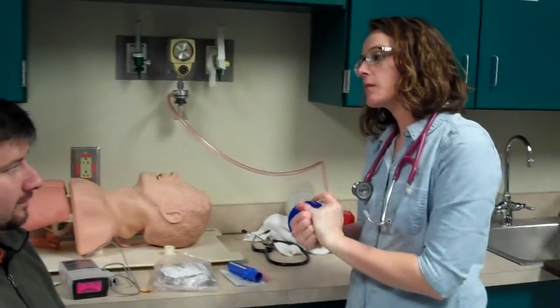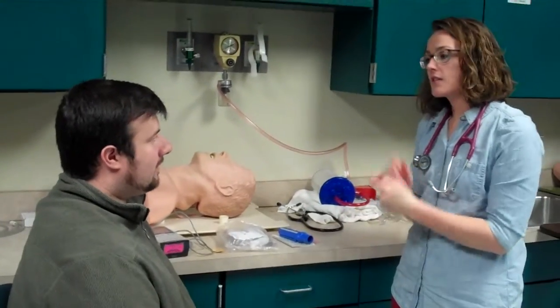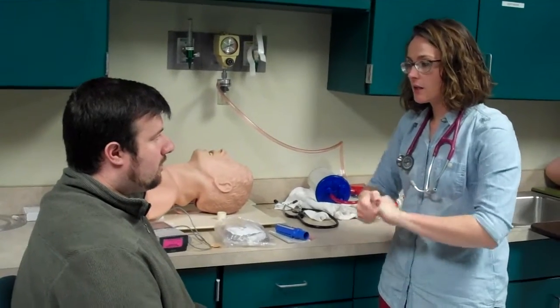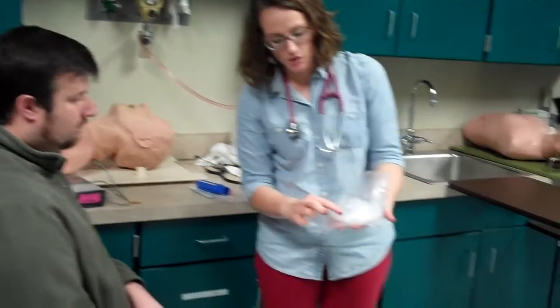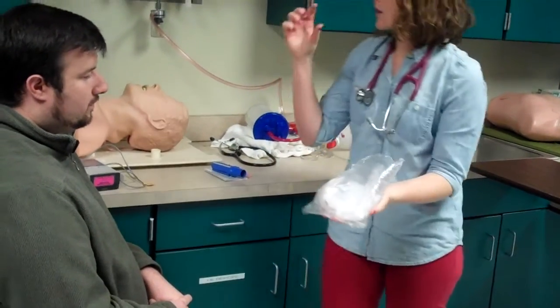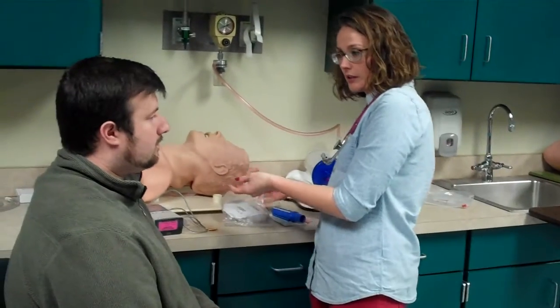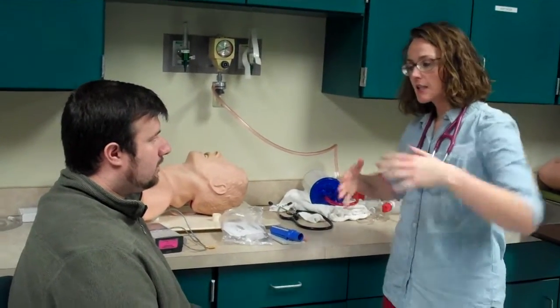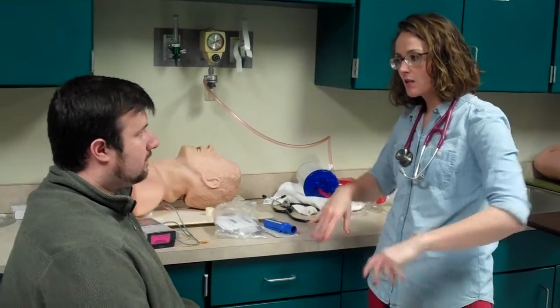Have you ever had a breathing treatment before? You haven't? Okay. What it is, your doctor ordered for you to have a breathing treatment. I'll set it up and show you, but you just put this part in your mouth. And you're going to be able to see the mist come in and out as you breathe. We want you to breathe normally. And periodically I'll tell you to take a deep breath and hold it there because we want to make sure all that medication is getting in there.